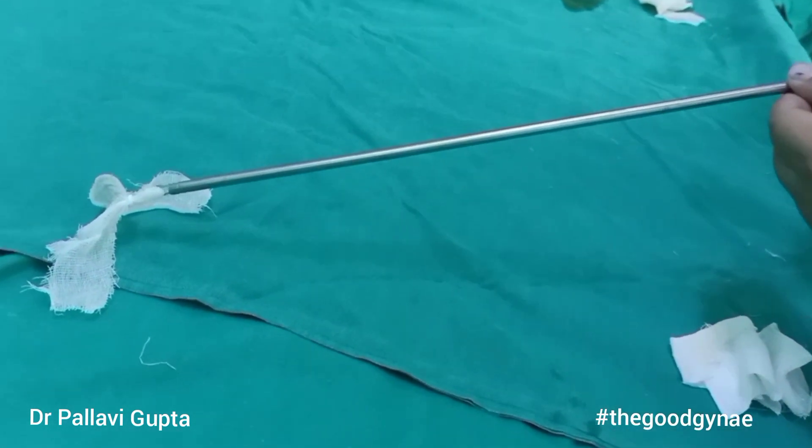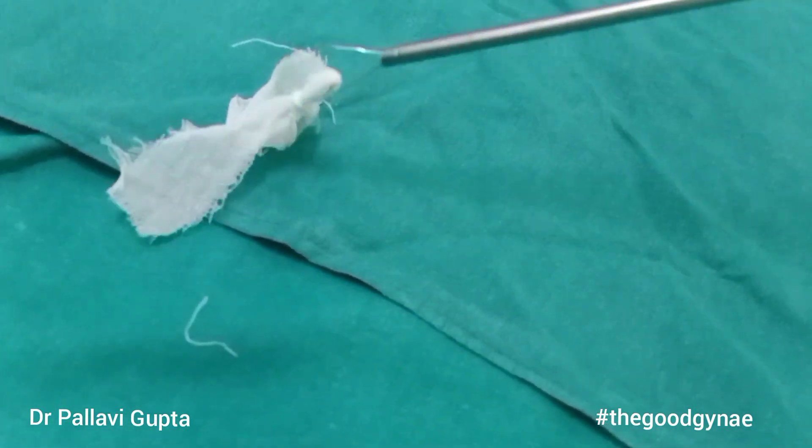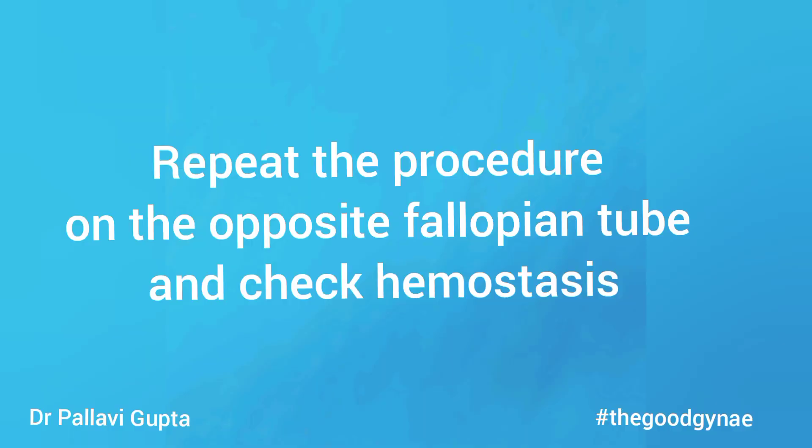The fingers are again moved away from the thumb, which opens the jaws and releases the tube out of the lumen of the laprocator. The application of the ring over the fallopian tube is checked. The procedure is repeated on the opposite side and hemostasis is checked.